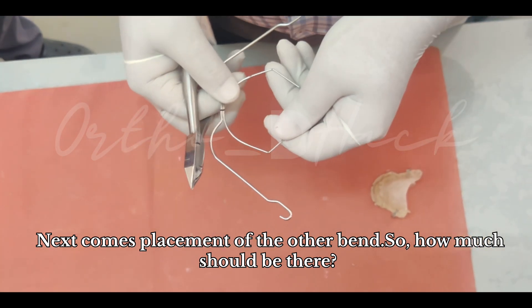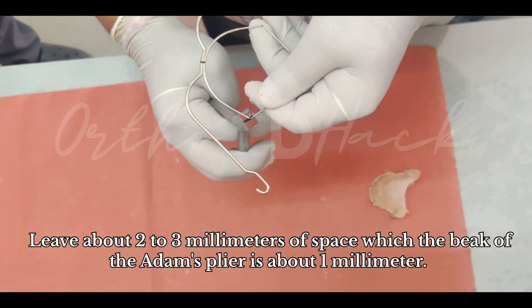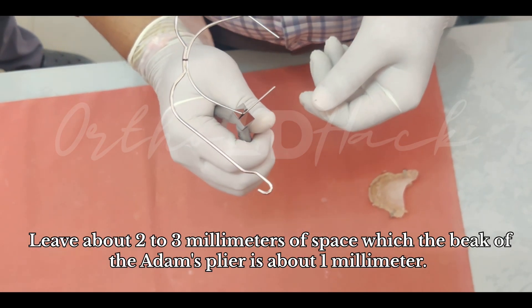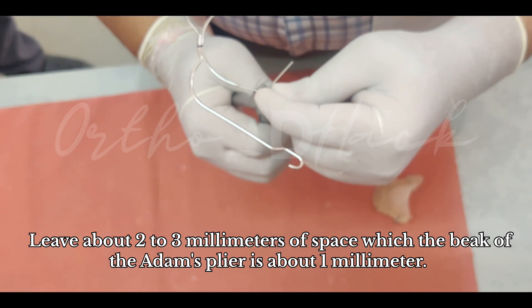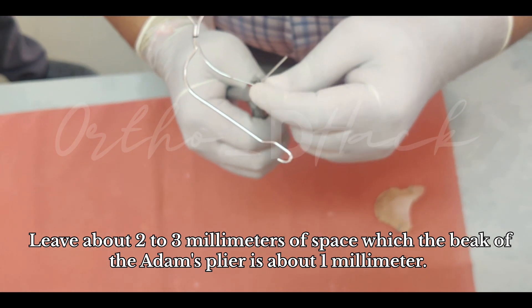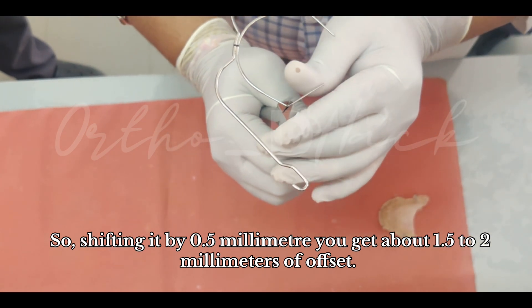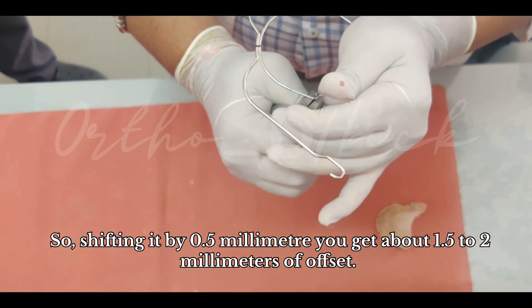Next comes placement of the stop bend. Leave about two to three millimeters of space. The beak of the Adams plier is about one millimeter, so shifting it by half will give about one and a half to two millimeters of offset.